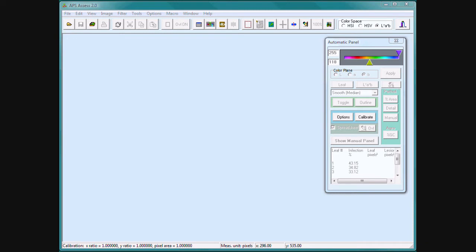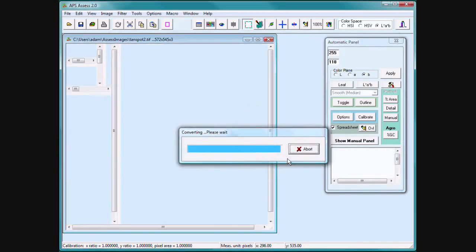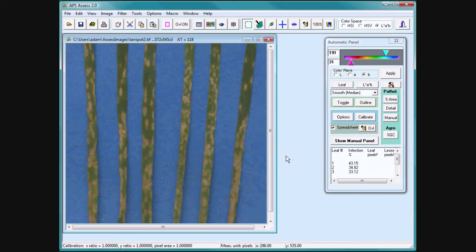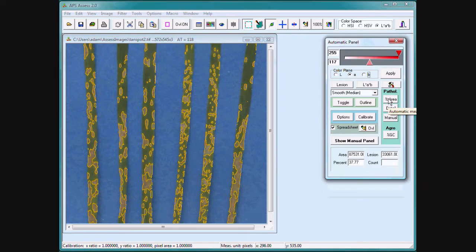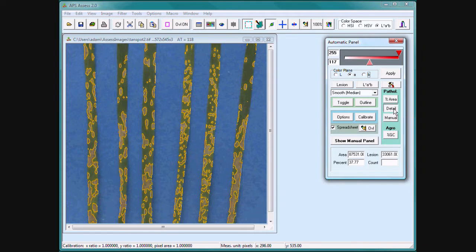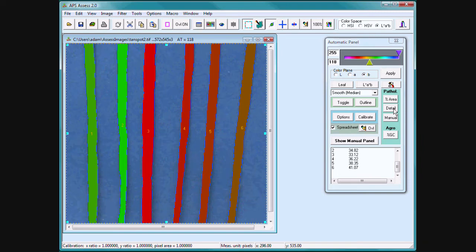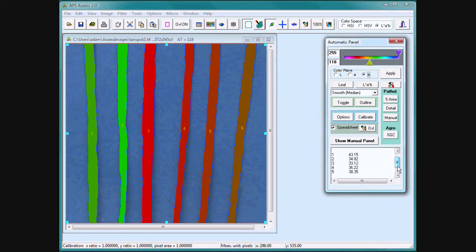If you have an image that contains multiple leaves on a uniform background, pressing percent area calculates percent infection for the entire image. Pressing the detail tab counts the number of leaves and calculates percent infection for each leaf.